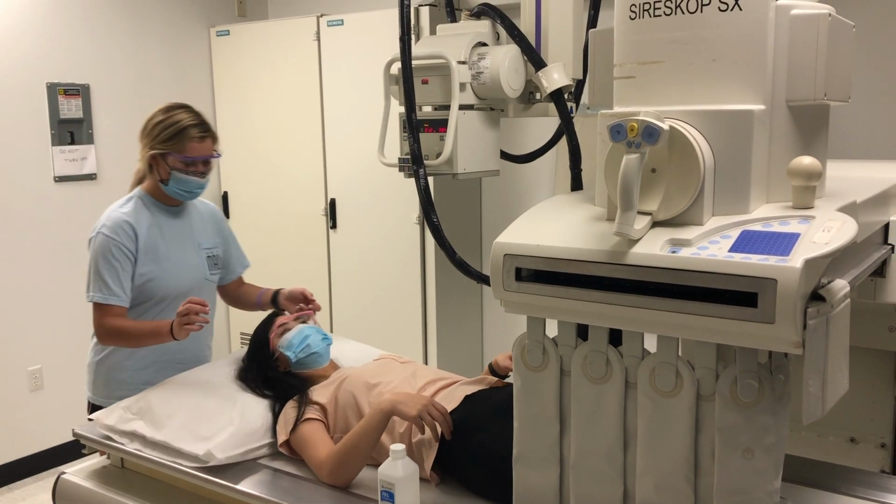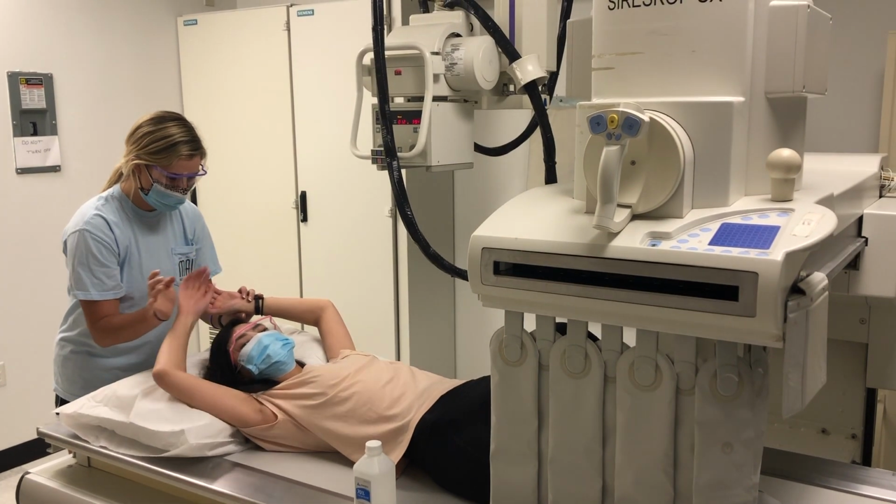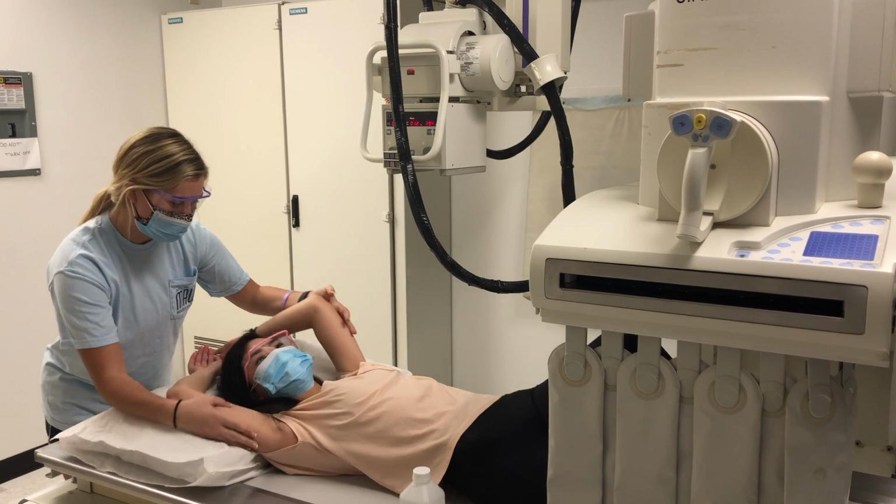Oftentimes, the patient will need to be held in place by immobilization devices or be assisted by a parent or technologist in order for the fluoroscopic procedure to operate smoothly.